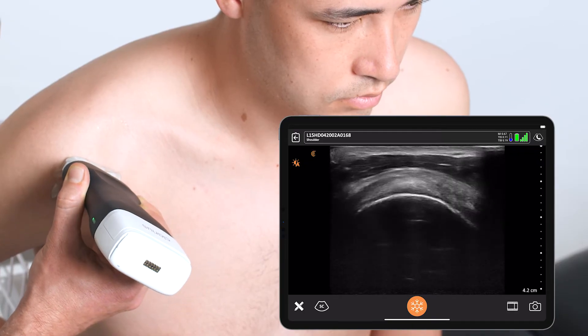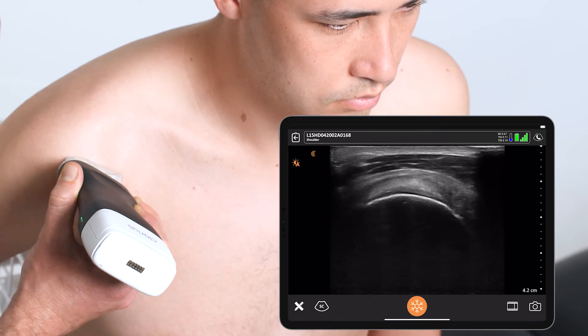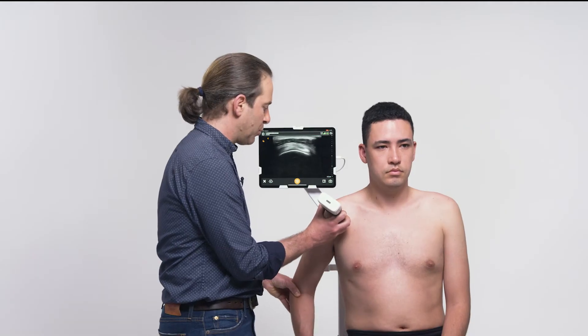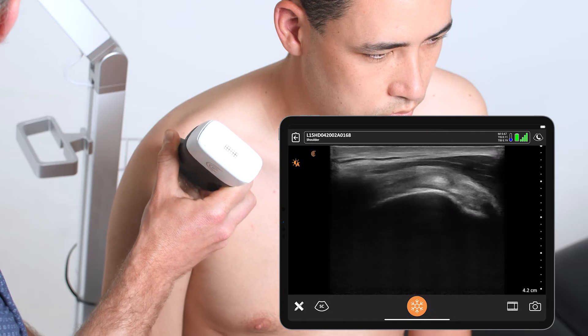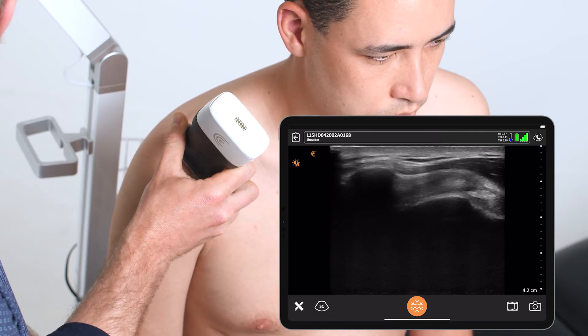I'll follow the rotator cuff looking for any full thickness tears or calcifications along the tendon. Once satisfied, I can bring their arm back into neutral and identify the acromion here as a separate cortical shadow.